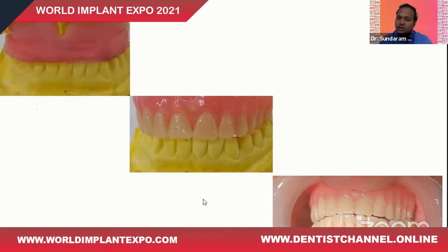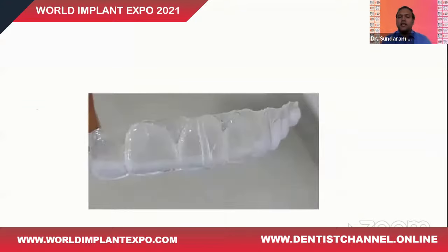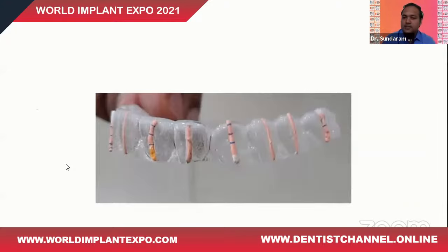Now, how was this helpful? Because after this, I'm going to construct a vacuum wafer. This wafer is helpful for me to create grooves. I create vertical grooves where the future implants are going to be placed, and these grooves are going to host radiolucent or radio-opaque material.